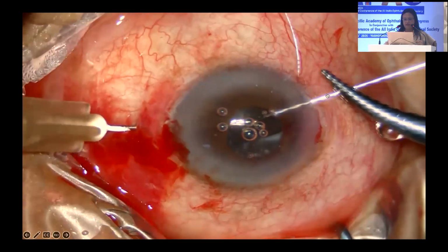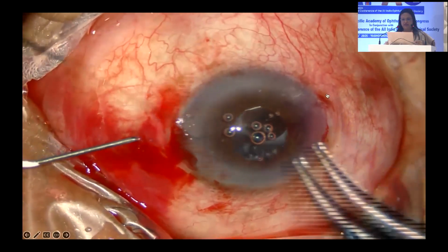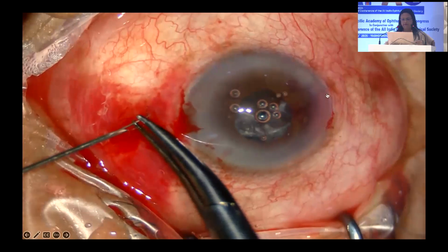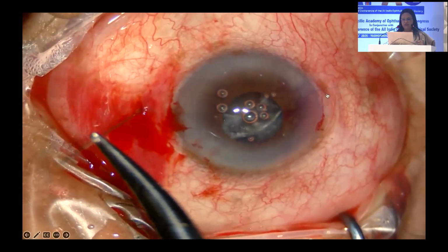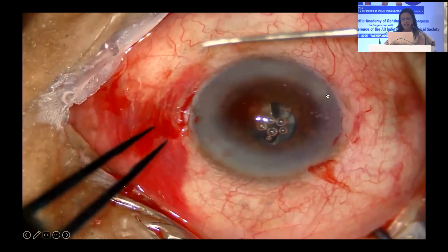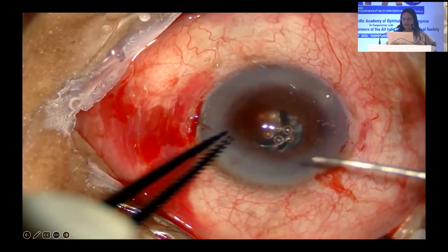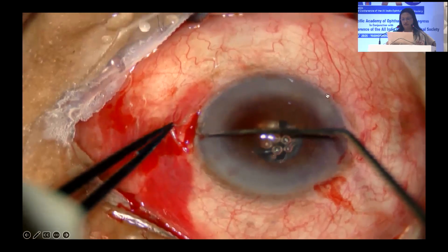Now the second end of the needle is going on top. The first one went underneath, the other one goes on top, whichever way you want, and you can see the lens is being pulled towards one side, and now you leave it like that. You just trim the sutures and leave it like that. You can tie it at a later date. So now you can come to the other end of the haptic.